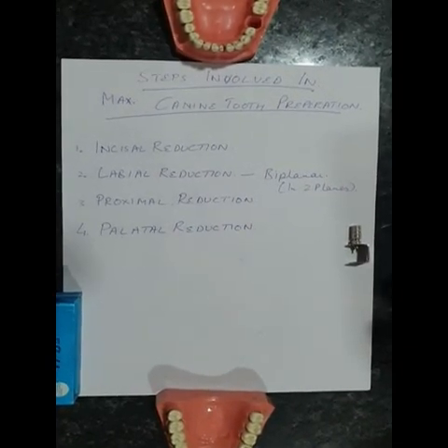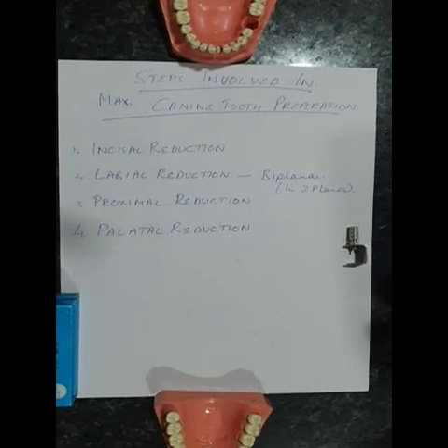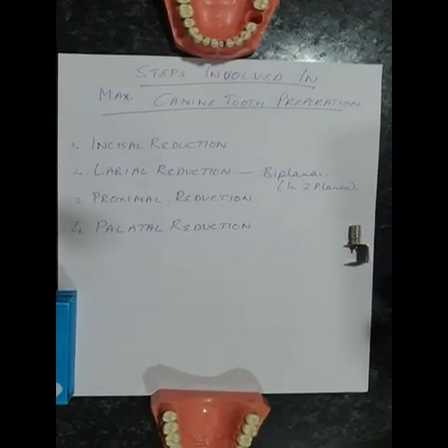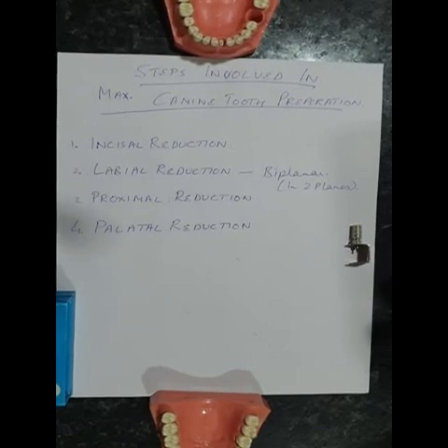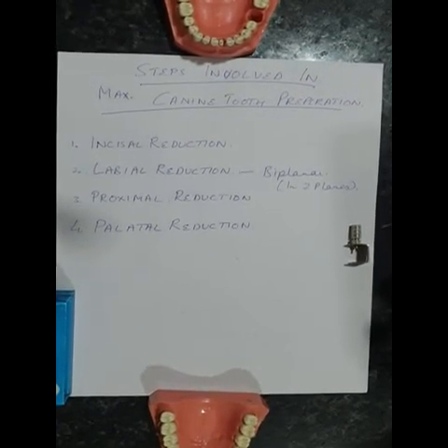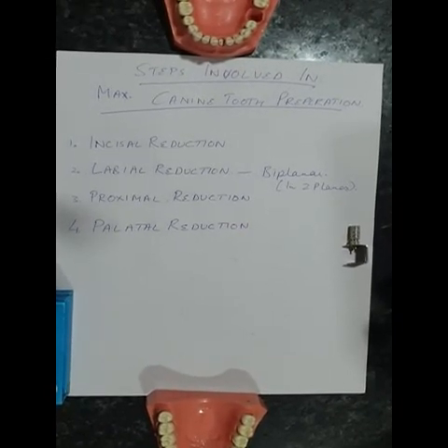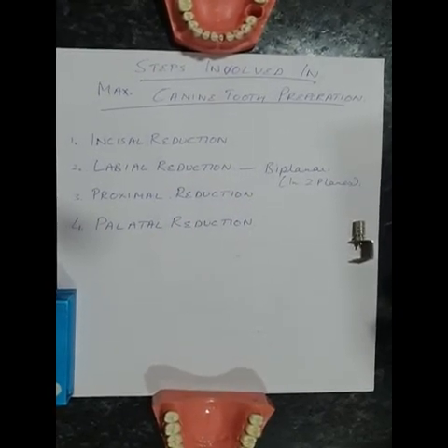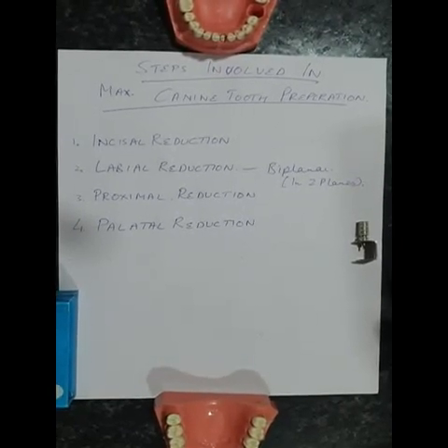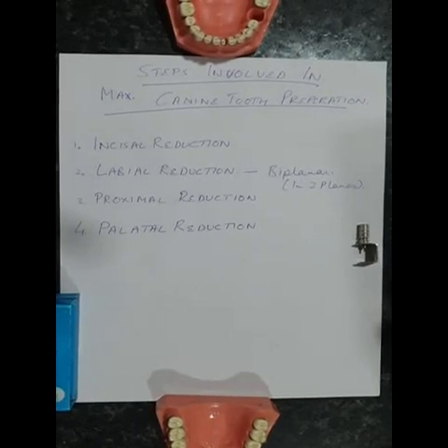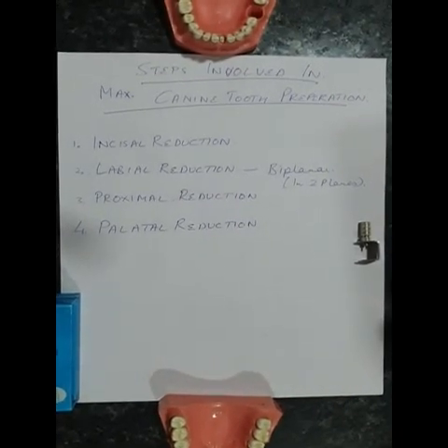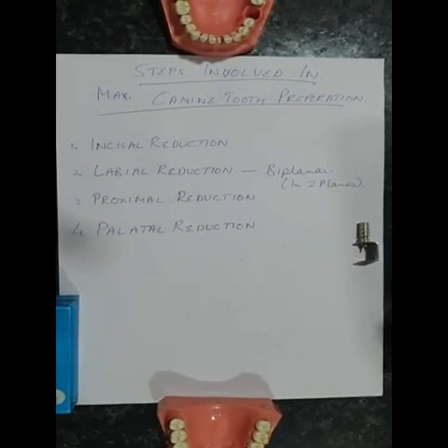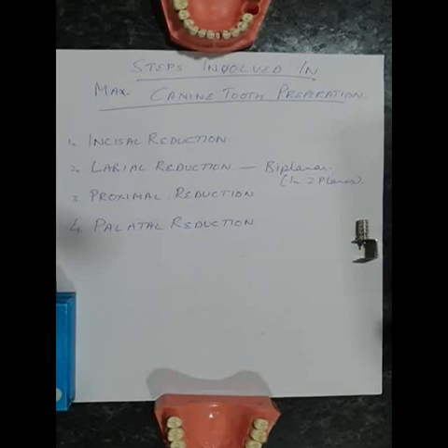Now I am going to tell you the various steps involved in preparation of a maxillary canine. The first step is incisal reduction, wherein we give depth orientation grooves on the incisal edge. In the case of a maxillary canine, the incisal edge has two slopes — mesial and distal. So we have to give our depth orientation grooves following both the mesial as well as the distal slopes. After giving the depth orientation grooves, we need to flatten the incisal edge, taking care that our bur is not reducing more tooth structure than indicated by the depth orientation grooves.